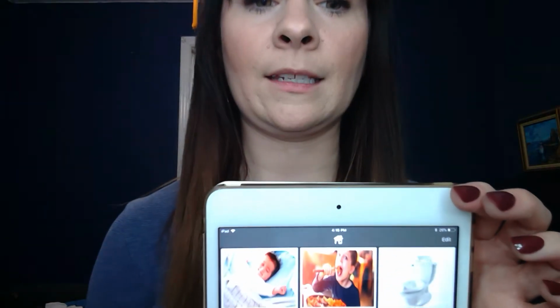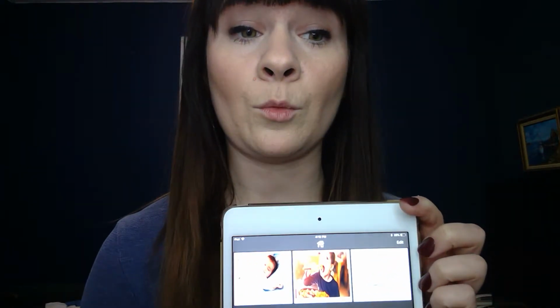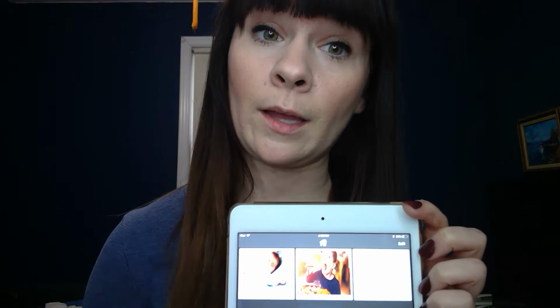Now, for this to be successful, you would require some pretty significant training, such as hand-over-hand prompting, so they understand which one signifies what. Again, the purpose of this device, at least for the free ones, is so you can build up exactly what you're looking for.